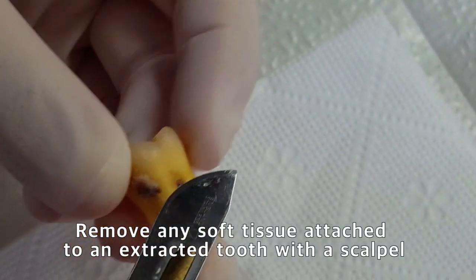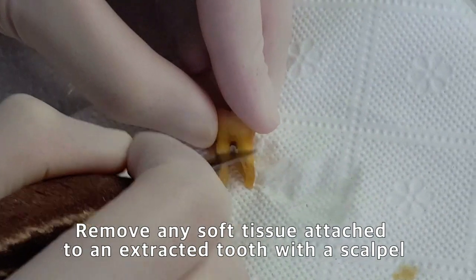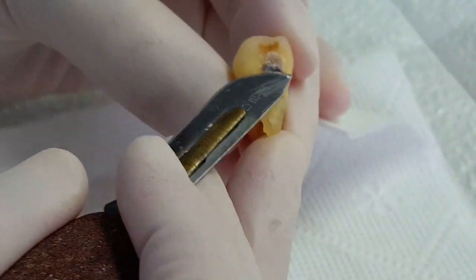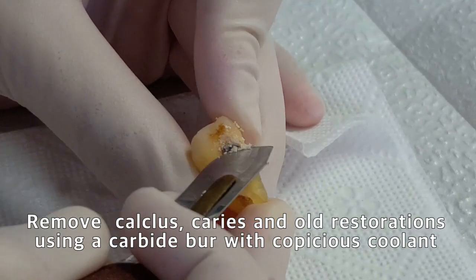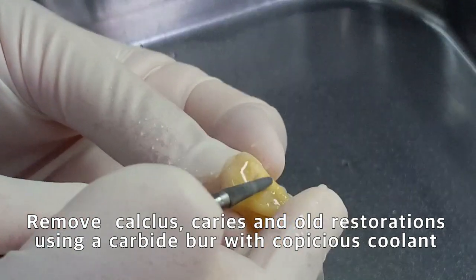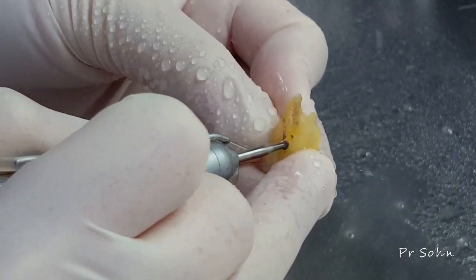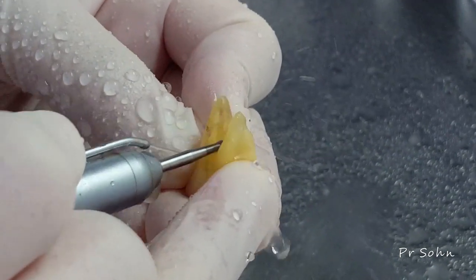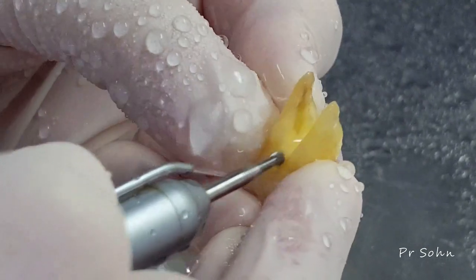After the tooth is extracted, all soft tissues attached to the tooth are removed with a scalpel or high-speed bur. Old dental restorations, dental caries, and calculus remaining on the tooth must be completely removed with a high-speed bur. When removing these foreign substances using a high-speed handpiece, sufficient coolant must be supplied in order to prevent denaturation of osteoinductive proteins in dentin.